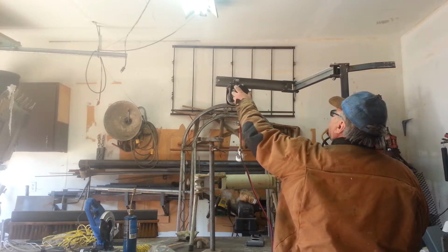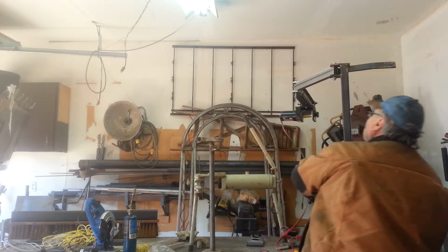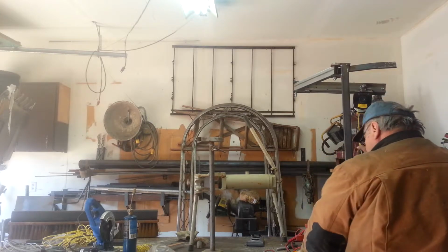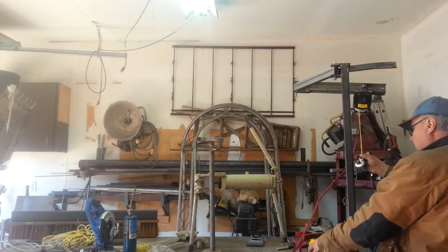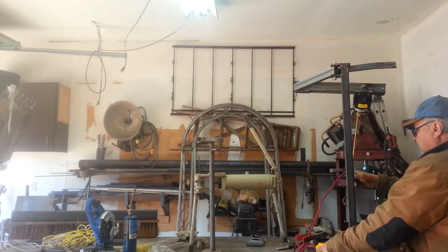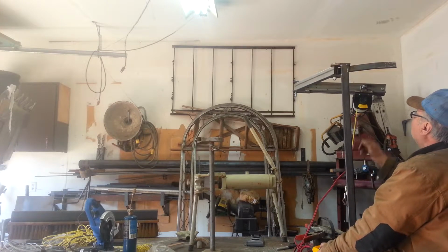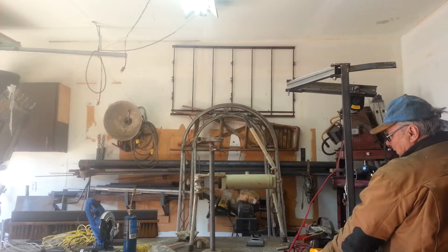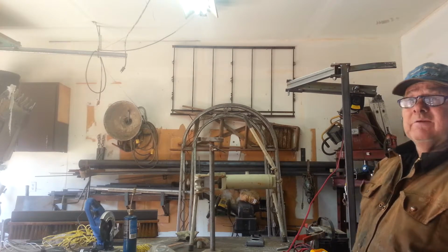So now you just slide this thing all the way back, roll it right around to its position facing the back of the van. Hook her back in the hook, and it really can't go anywhere. It might pivot back and forth, but it can't swing around and get her in the back of the head.